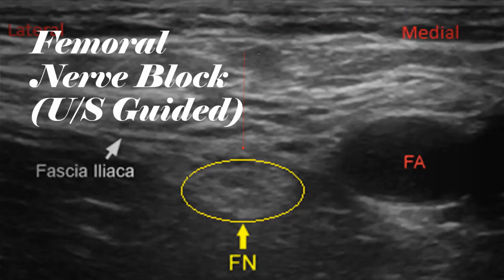lignocaine. And what will happen is that it will start to form sort of like a ball. You'll see a ball of lignocaine, and this yellow part would actually get pushed down. That's how you know you're in the right place. So you get a flattening of this because you've got lignocaine above there. And the lignocaine, of course, will affect the myelin sheathing as it normally works, and you would eventually get anesthesia in that area.